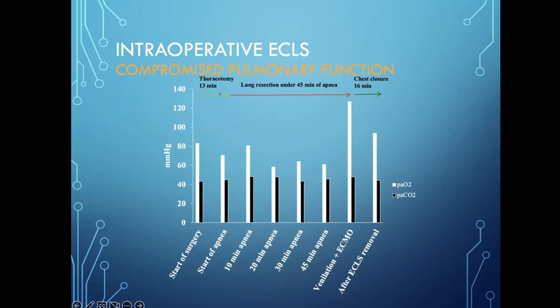We hadn't got that great practice on segmentectomies, on such segmentectomies, segment 8, for example. So it was a thoracotomy we performed at that time, a limited one, actually. And afterwards, you can see that we actually had like 45 minutes of apnea only by inserting a twin port cannula and applying some apneic oxygenation. So that was sufficient time to take out the segment and the lymph nodes.